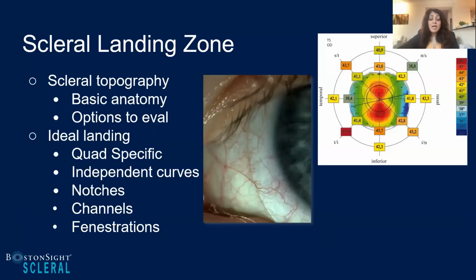Avani, you mentioned the architecture of the sclera. One of the things that we know about the anatomy of the sclera is the closer you get to the limbus, the more dense, solid and rigid the sclera is. The further away from the limbus, the softer and spongier it is. When you're dealing with a larger diameter, 18 millimeter Boston Sight Scleral lens, you're going to deal with a lot more irregularity. So you're going to need to make some more changes to that edge design as opposed to having a much smaller lens. But you have the ability to have quad specific changes, and you can make those alterations by having those quad specific designs.